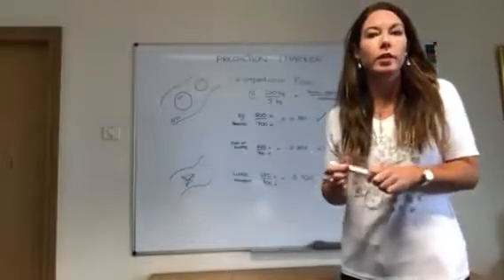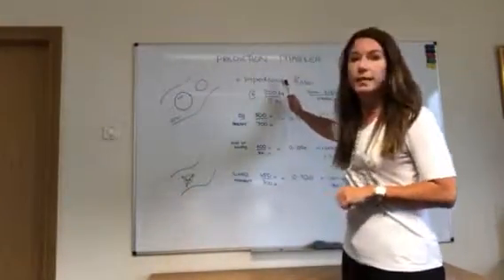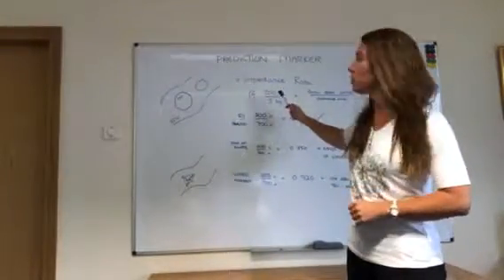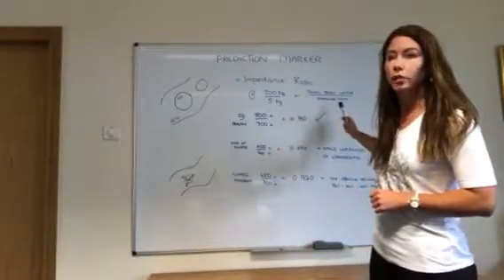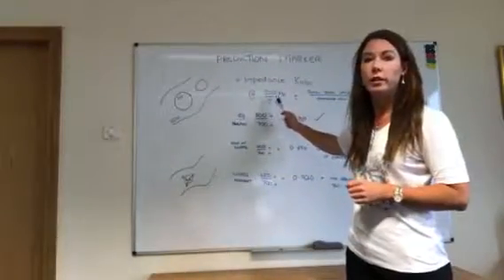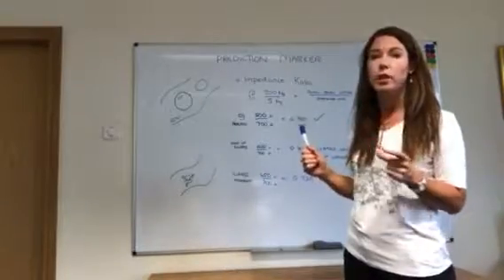This is just a quick video to explain the prediction marker. The prediction marker is basically an impedance ratio of 200 kilohertz over 5 kilohertz, which equates to total body water over extracellular water. At 200 kilohertz, the current is quite strong, so the resistance is much lower.